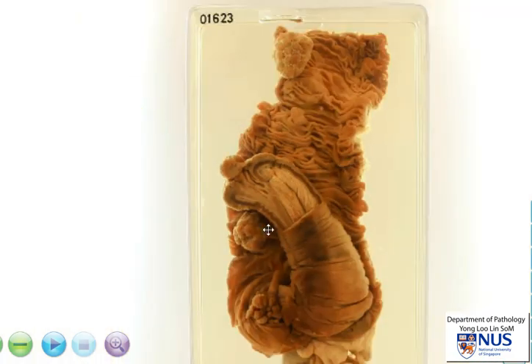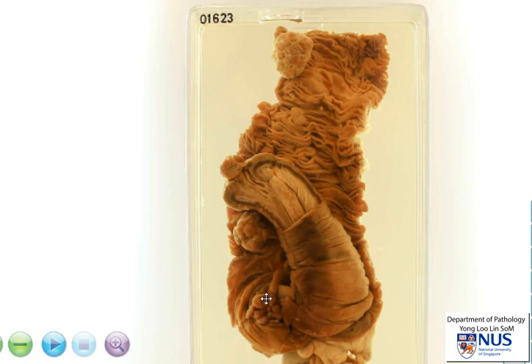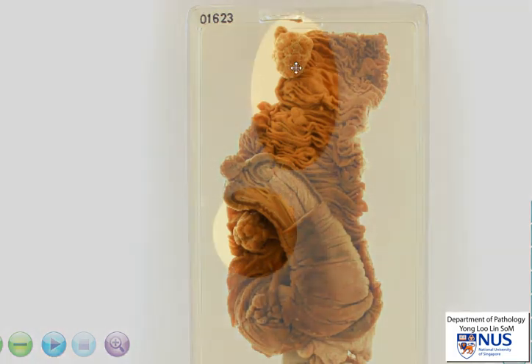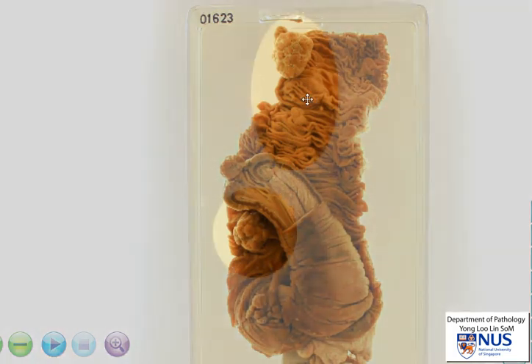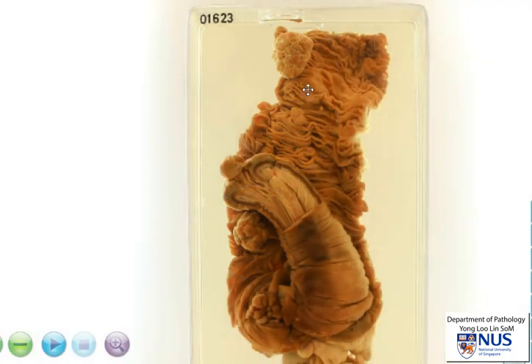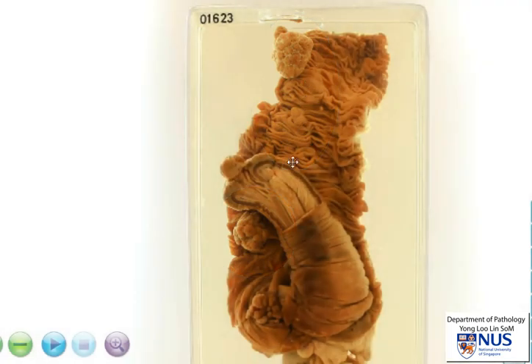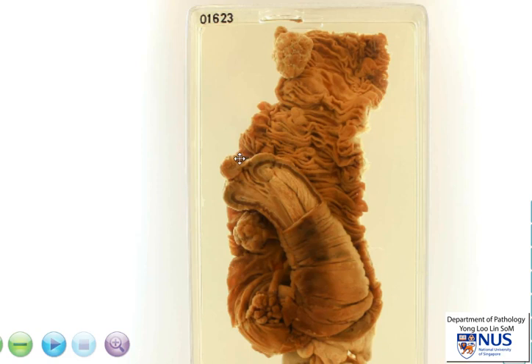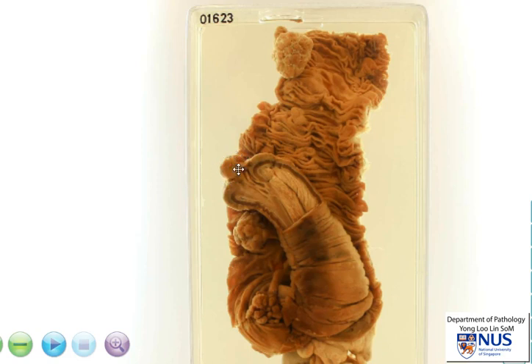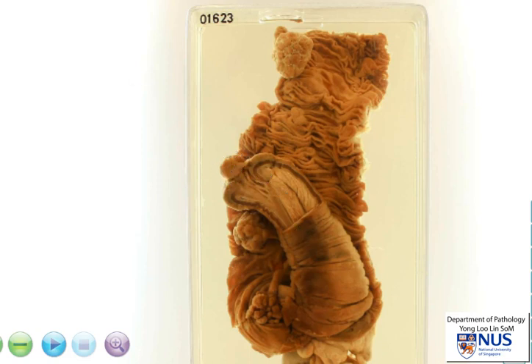In fact, the rest of the colon shows the presence of several other polyps, as you can see. So this is probably a case of polyposis — perhaps attenuated polyposis, because there aren't that many polyps — but certainly this is likely to be the mechanical cause of the intussusception.